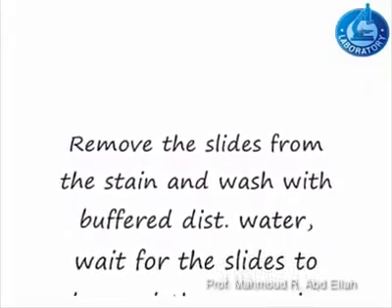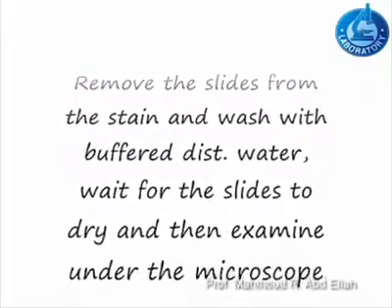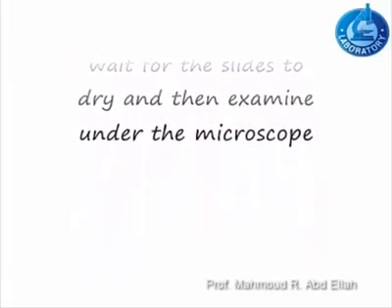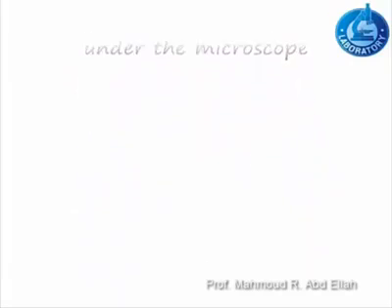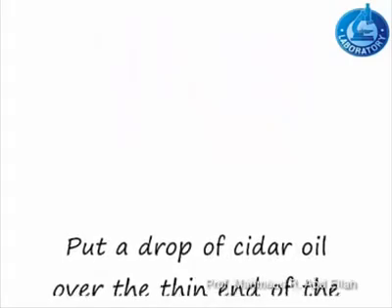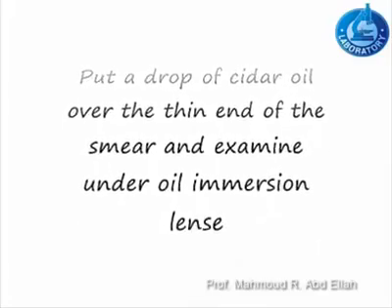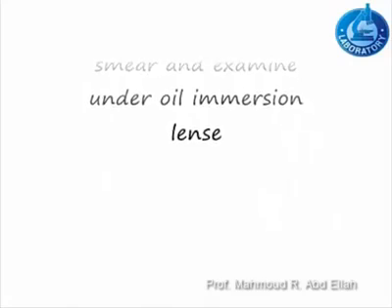Remove the slides from the stain and wash with buffered distilled water. Wait for the slides to dry, and then examine under the microscope. Put a drop of oil on the thin end of the slide and then examine under the microscope.